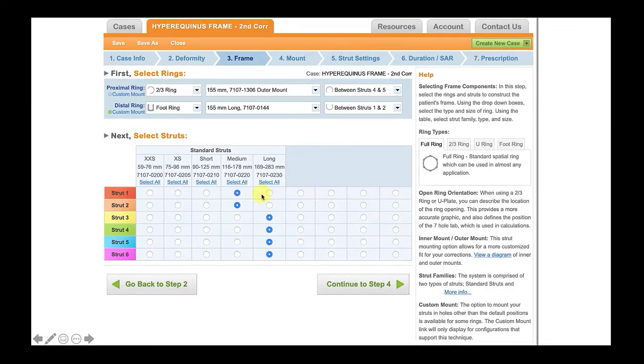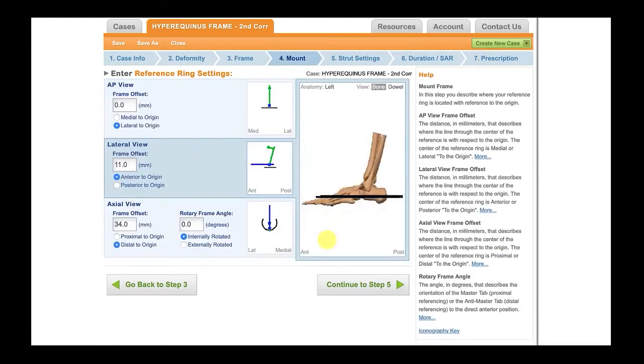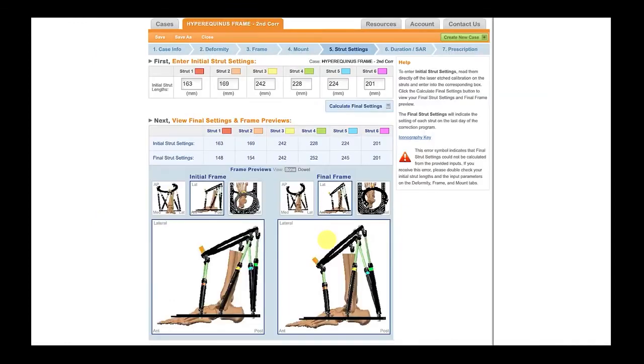And you know, we did a few strut changes, and the computer recognized the fact that we did those strut changes, and so it automatically populates this spreadsheet with the new struts that we put in. The rings are the same, the custom mounting is the same, so none of that changes. We'll go to the next panel, the mounting parameters. And since we really didn't move anything, the ring stays where it was. There's no changes in the mounting parameters. The computer automatically recreates the original mounting parameters that we had. So we can go to the next one, which is the strut settings.